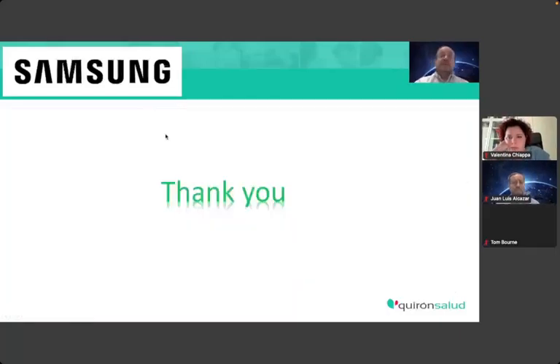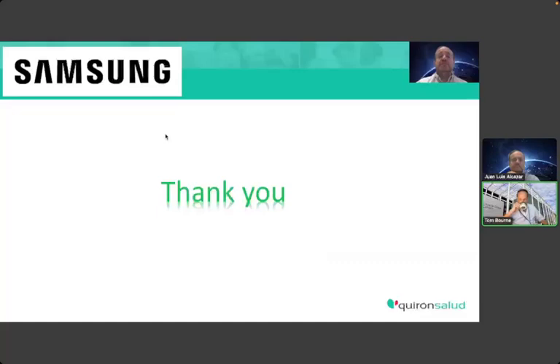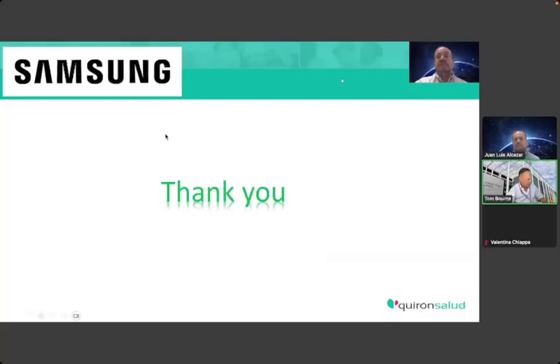Well, I'm done with this lecture. Thank you very much for your attention. I hope you have enjoyed it, and you have observed how you can use this protocol inbuilt in your machines, guiding and helping you to perform a scanning in a lady with suspected pelvic endometriosis.